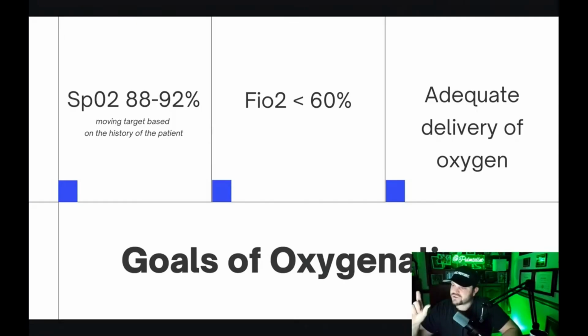So if it's a monitoring device, you would want to see it go from like 95 to 90, because then something's happening. If you're hyperoxygenating, it's like 100% and it goes to like 98%, even though it's a little bit of a change, you might not pick it up as a monitoring device. So I thought that was pretty interesting when you brought that up.